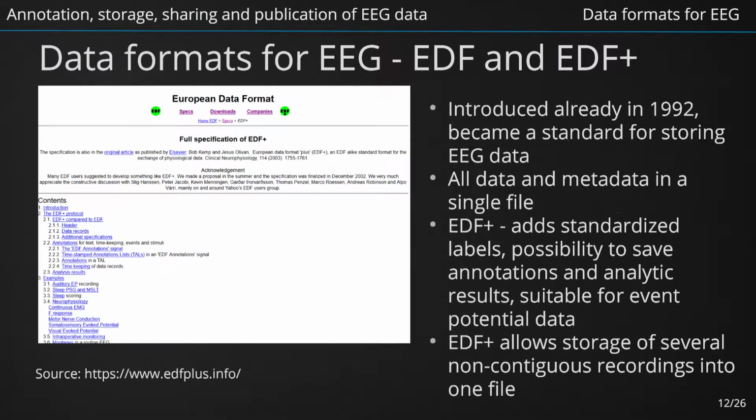All information in one single file is on one hand an advantage of the format. It is a simple solution. On the other hand, all information in a single file violates a basic rule of data management: separation of data of a different nature, data and metadata in our case. The disadvantages are then, for example, definition of terminology within a fixed structure, inability to define metadata subgroups, or possible performance difficulties when reading the data records.